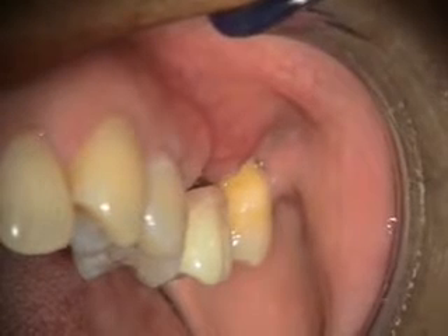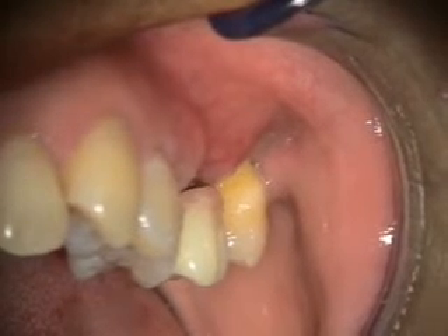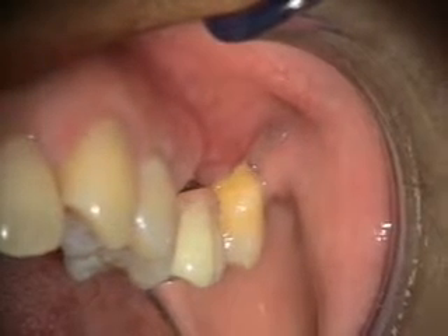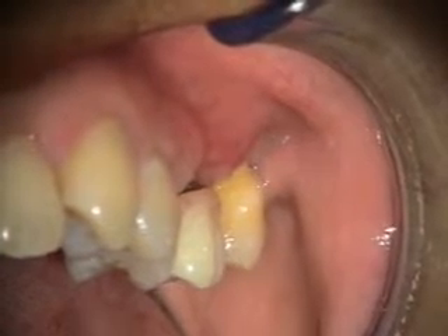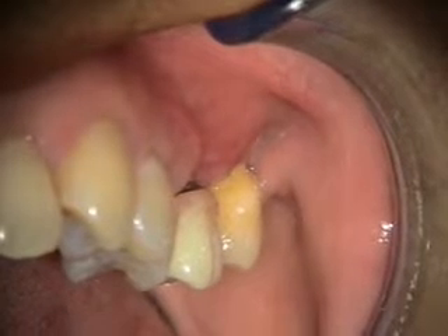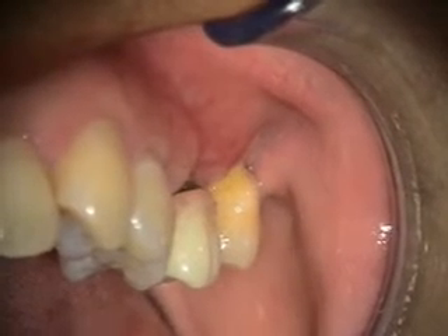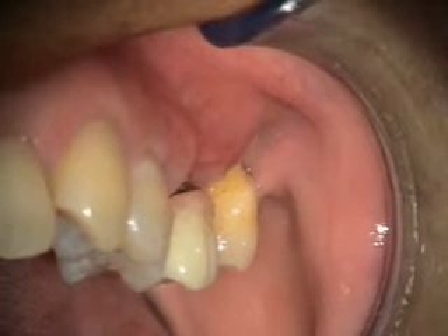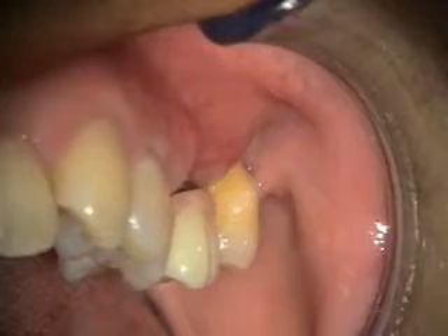This is a two-week healing of the implant placement at number 14 with the augmentation on the facial. You can see that that's worked out really well — it's probably going to flatten out and shrink a little bit, but for two weeks that's looking good. Then we're going to reline her stay plate a little bit so it fits a little better.